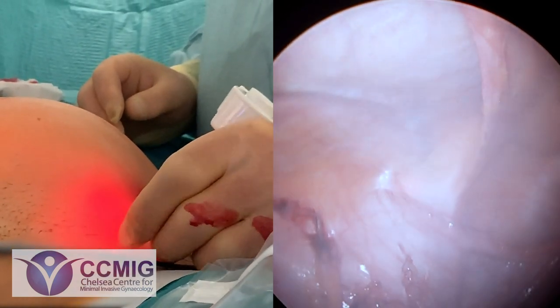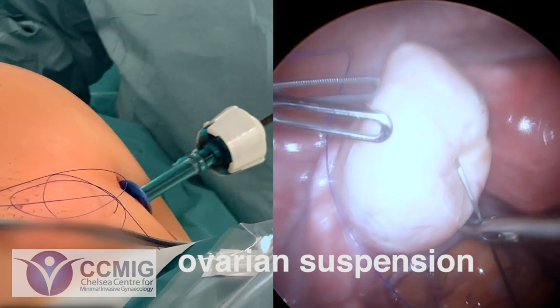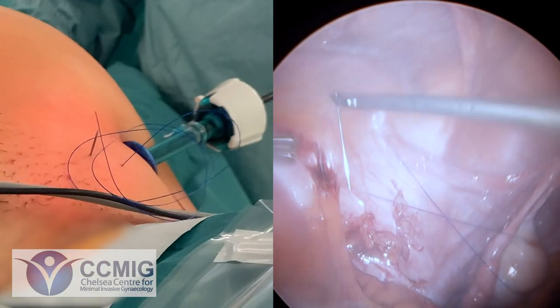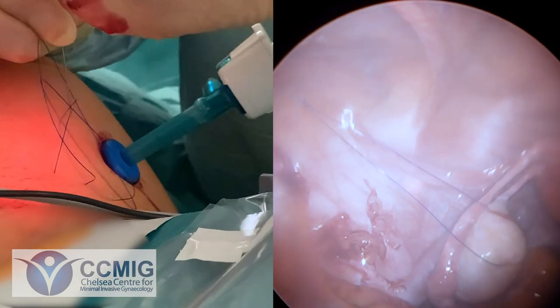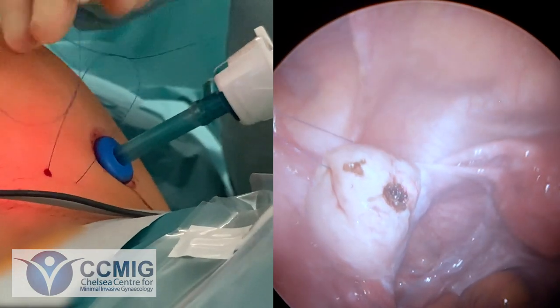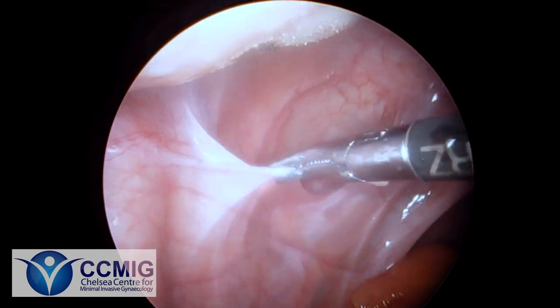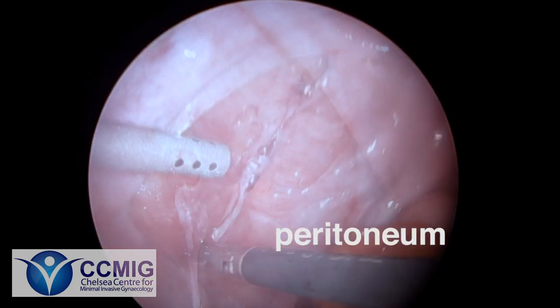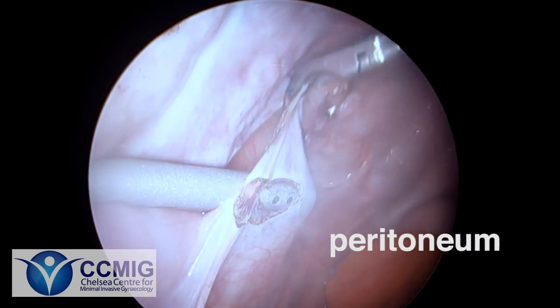The ovary often falls down under gravity and it can make dissection of endometriosis quite tricky, so in this case we're performing a procedure called ovarian suspension. We're using a stitch that goes in through the tummy on the left hand side to attach the ovary to the anterior abdominal wall. This looks fairly brutal but actually the ovary is very happy being stitched in this way — even as part of some fertility procedures a similar thing called ovarian drilling happens to improve the ability for the ovary to produce eggs. This is a stitch that's going to be removed at the end of the procedure, so we just place a small clip to hold everything in place. You can see the ovary easily being lifted away, just resisting gravity, so we can clearly dissect down on that left hand side. Now you can see this peritoneum being lifted up — this is normal healthy mobile peritoneum that we're excising away with the laser. We're taking away quite a large area, well clear of all the endometriosis, so there's a lower risk of recurrence after we've removed this patch. The laser cuts very cleanly through the peritoneum and has a low risk of damage to surrounding structures.